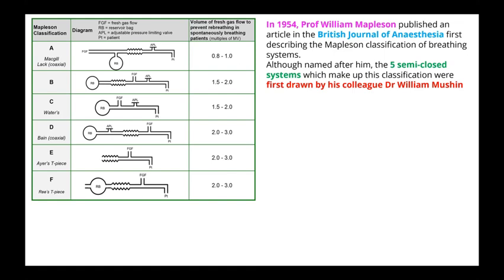You want to do supplementation and keep the tube in situ for some time. At that time, how do you supplement the oxygen to the patient? Have you not seen a T-piece being used there? Yes, sir. Supplemental oxygen through an endotracheal tube can be given only through a T-piece.